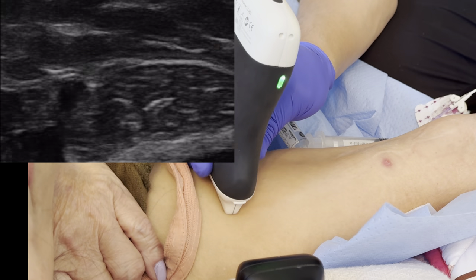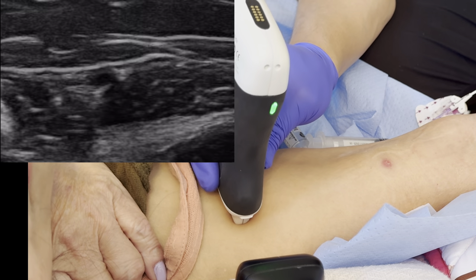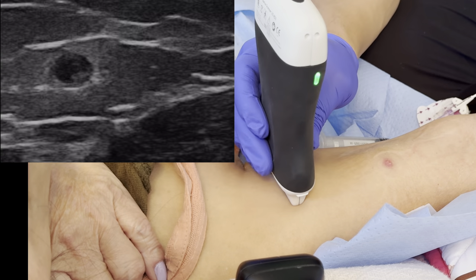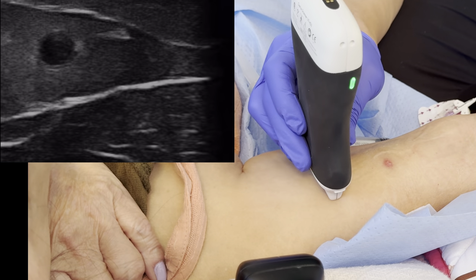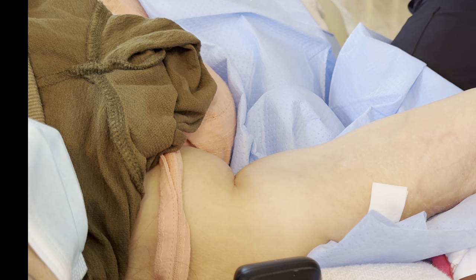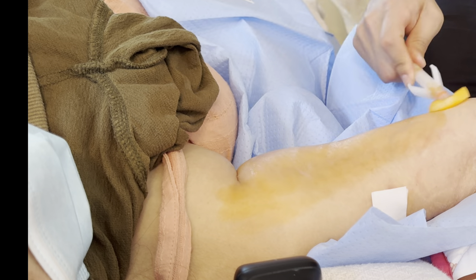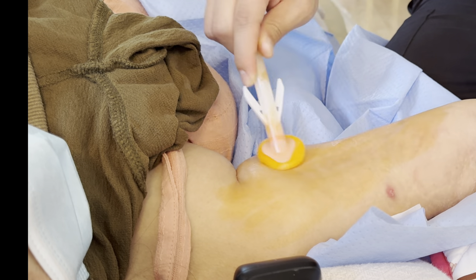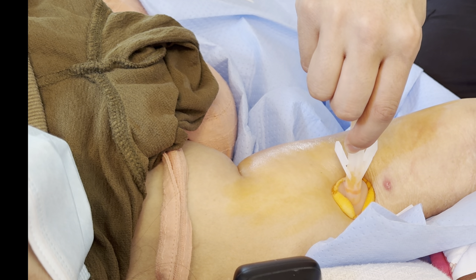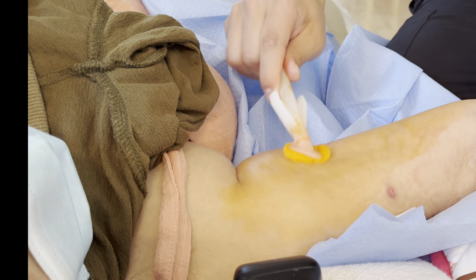This clot will spontaneously resolve and go away over time — it's pretty adhered and caught by the pathway of the veins. Still non-compressibility there. It seems to be a thrombus from about here — this is where the vein completely collapsed. Let's say the thrombosis ends here, then there's a partial, partial, partial, all the way to the insertion site. I like to do a full minute scrub, even though it pains me. So we're going to insert it about here, and I don't like to form midlines because I seem to change my mind about exactly where I'm going to go.